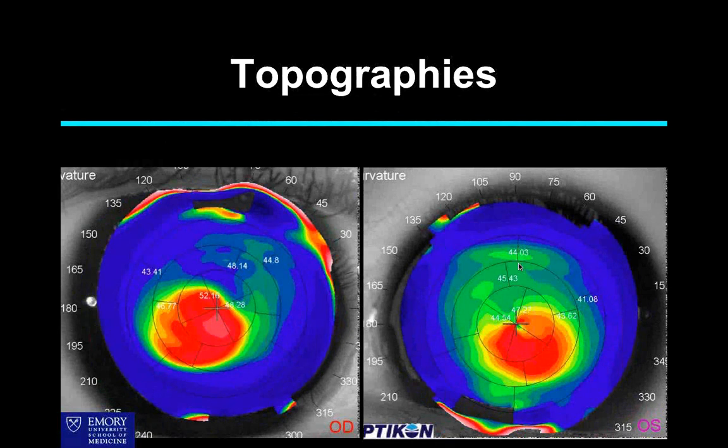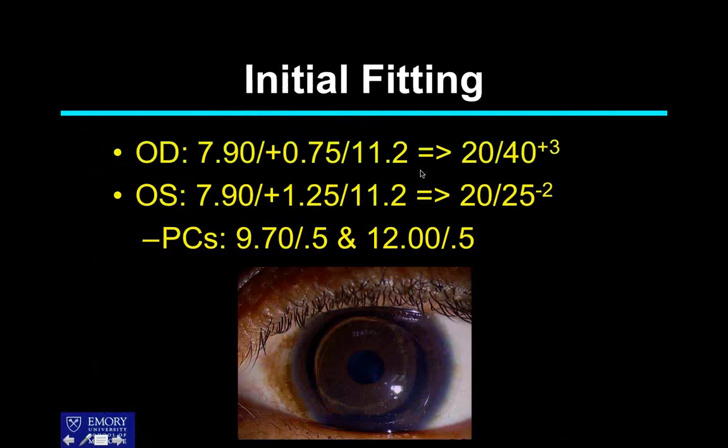And you can see on the left eye, you have some, what I refer to as macular sparing, like you would on a visual field. A little macular sparing right there in the middle, which is why this left eye sees so much better than the right eye, where the visual axis is really more obliterated by the larger area of red that we see there.